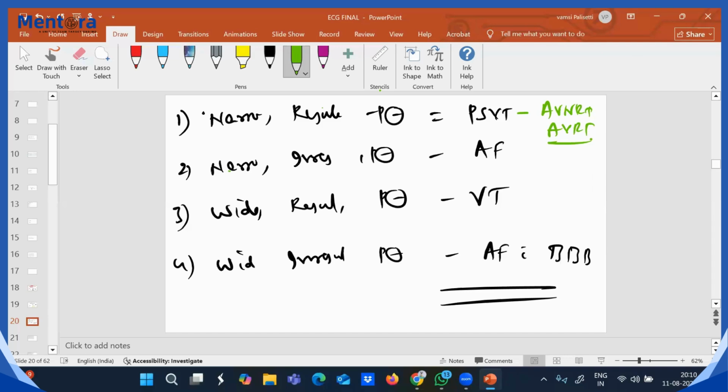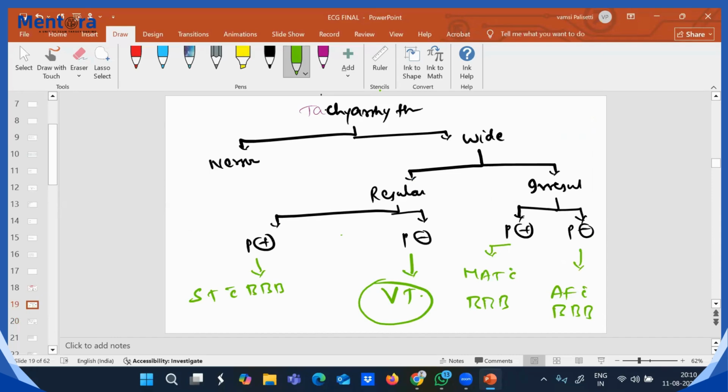Sir, if a bundle branch block patient gets PSVT. Very excellent question. So one more thing we missed here is, I don't want to confuse, that's why I missed it. Wide complex, regular, P wave absent is VT, and one more example is your SVT with bundle branch block. That's called SVT with aberrancy. Both are there. I just don't want to confuse the people, so I just didn't mention. How to differentiate is a magic. We'll discuss this in the last part of the class.